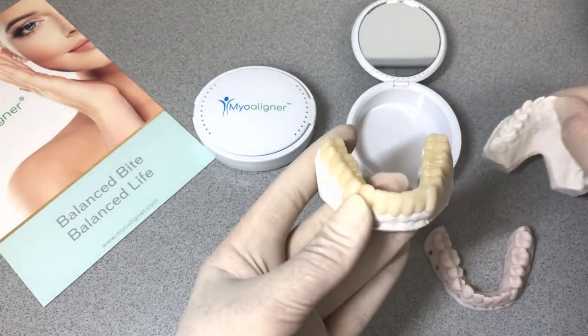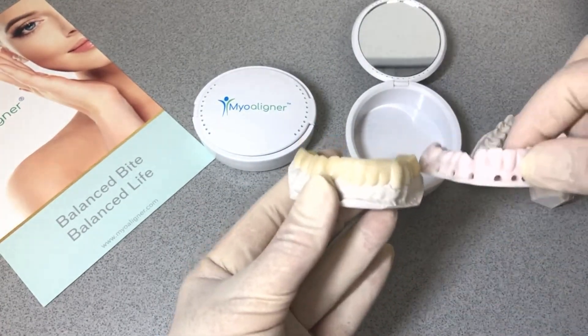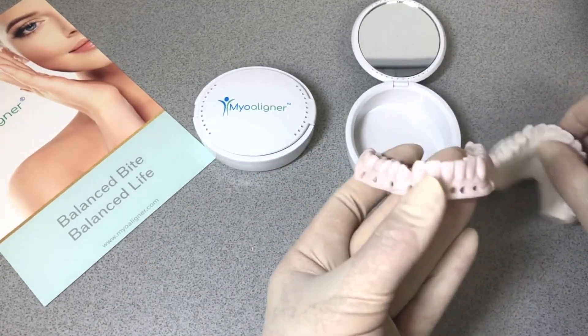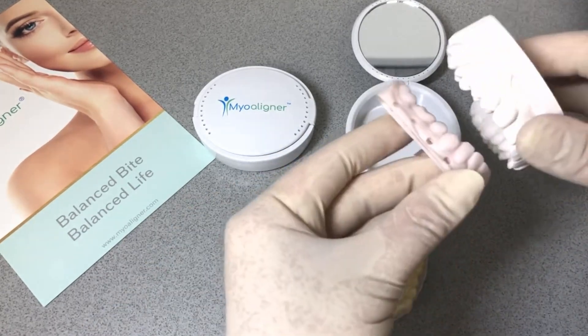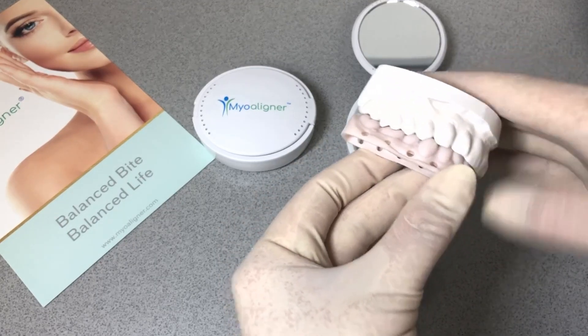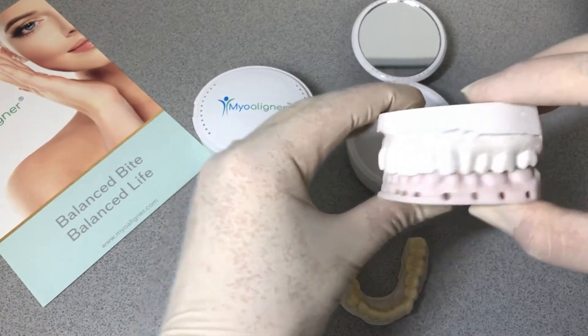The second design I wanted to share with you is the exact duplicate of the mandible in this case that we made with 3D printing. As you can see, this is how the occlusion fits with some retraction of that mandible.